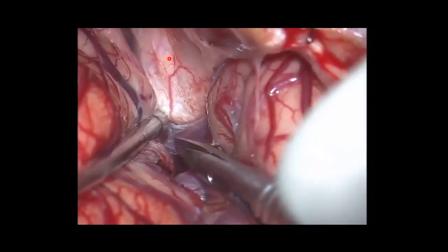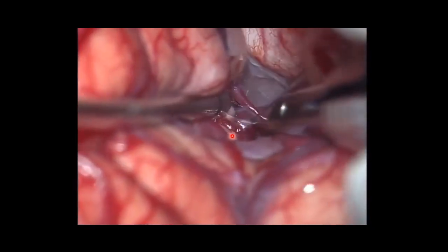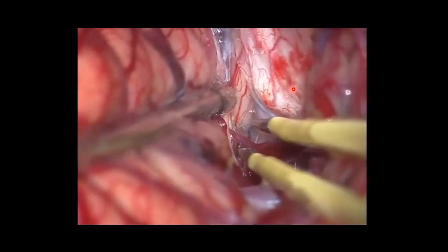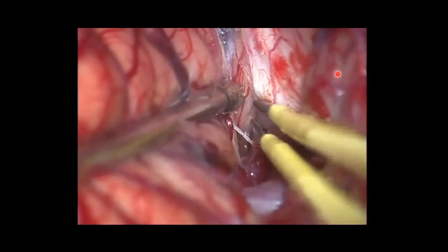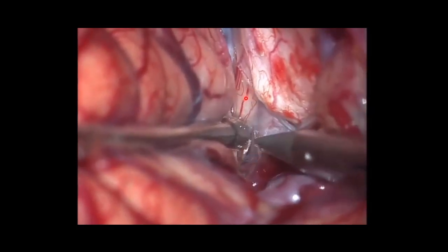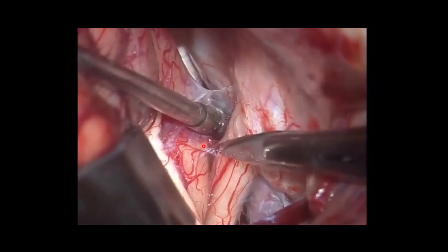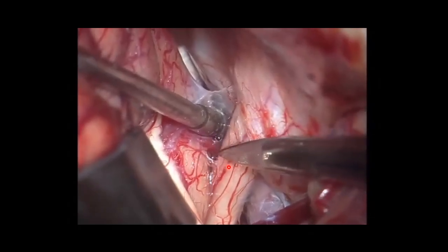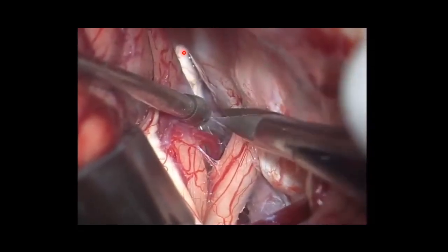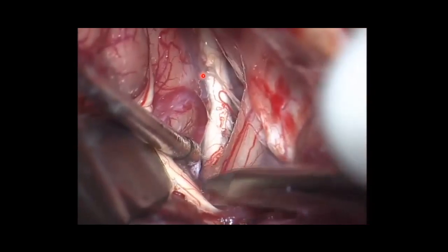And now there's always a vein crossing, running from the frontal orbital area to the temporal side, draining to the sphenoparietal sinus. So he's coagulating this vein and cutting. This is the right optic nerve, right ICA. Now he's separating the frontal lobe from the right optic nerve. This is the left optic nerve. Cutting arachnoid membrane. Now we have a better view of the left optic nerve.